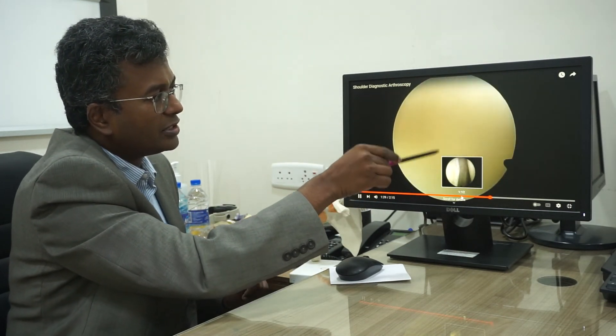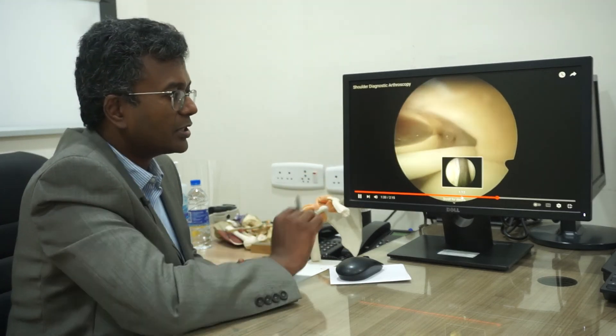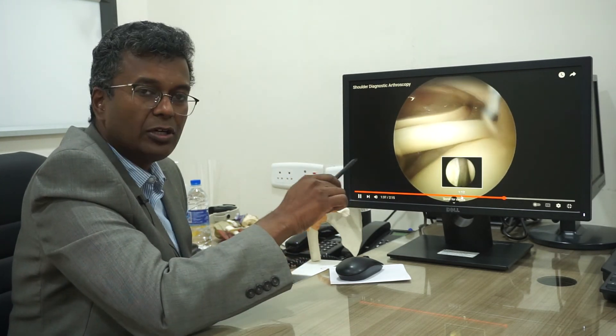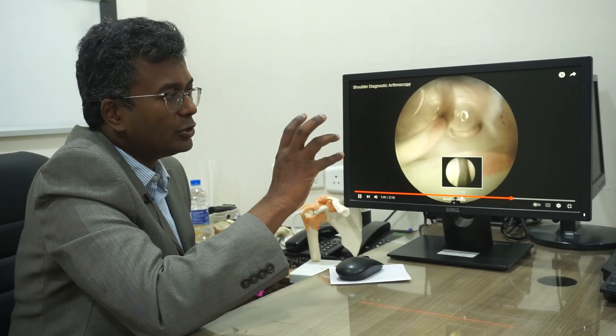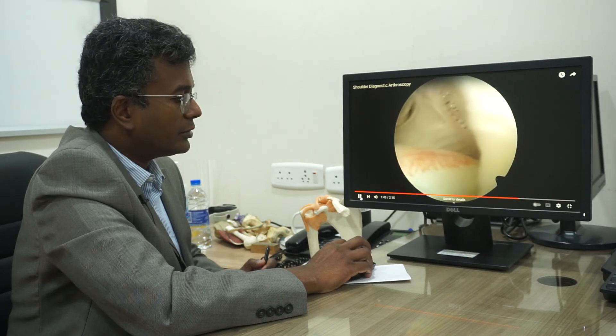We've now seen the posterior part as well, and coming again to the superior and anterior portions with the biceps. This is the normal shoulder anatomy — there is no pathology or problem in this shoulder. This is what it looks like when you go inside with the arthroscope during shoulder keyhole surgery. Thank you.